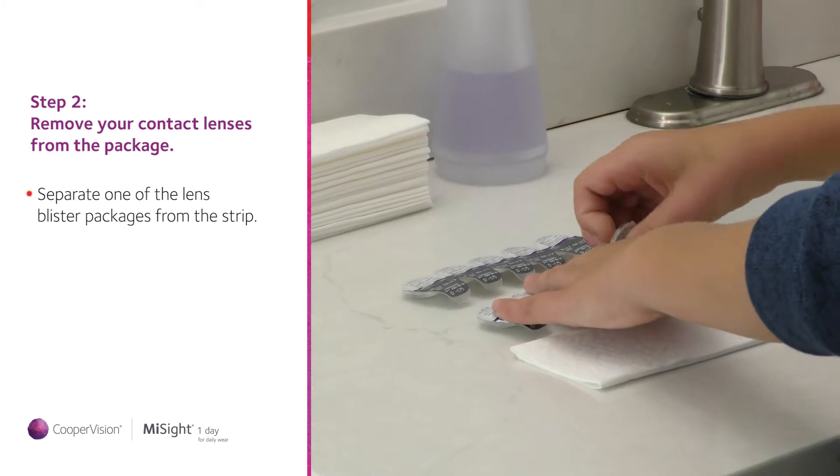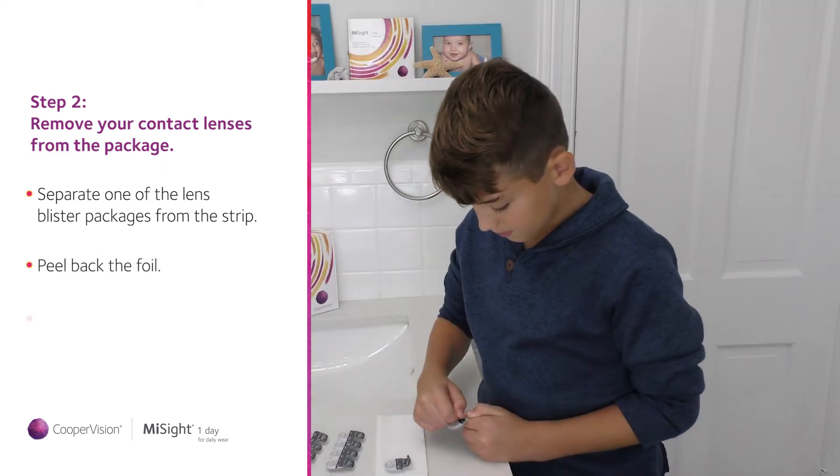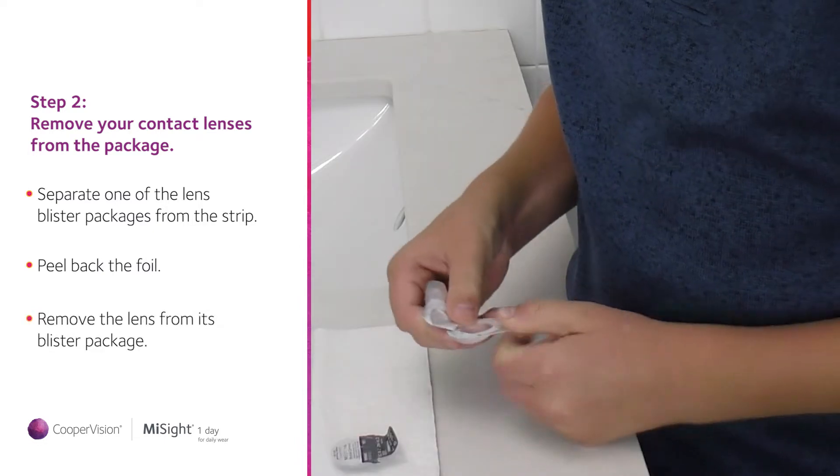Separate one of the lens blister packages from the strip. Peel back the foil and remove the lens from its blister package.